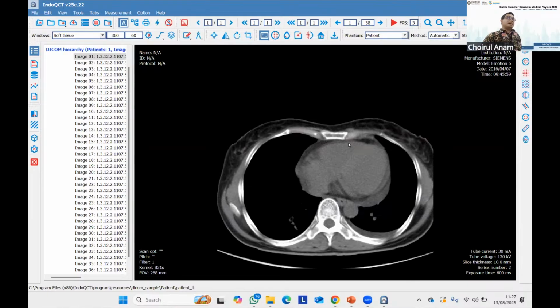But sometimes your slice thickness is very thick, so the size in the z-axis is not similar to the y and x axes. It is a problem if we want sagittal or coronal images. To overcome this problem, you use interpolation. But of course, the interpolation is not good enough.